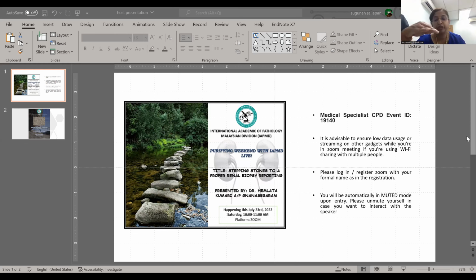They all have different stains. For example, in FSGS, you may see something that looks like an FSGS in the H&E stain, and in the first round of silver stain it looks more like an FSGS. Eventually, you need to confirm it. In the subsequent silver stain, you may finally find a full-blown FSGS.